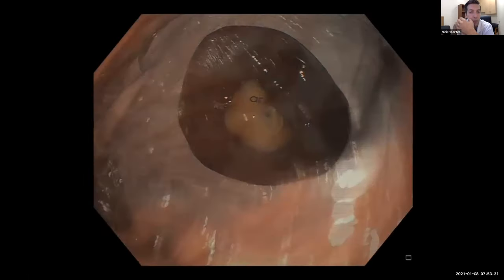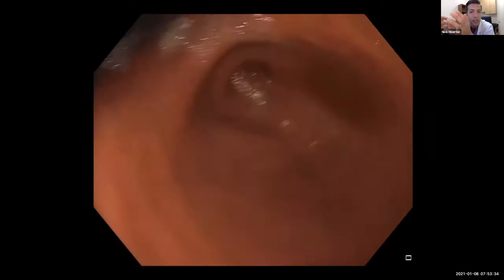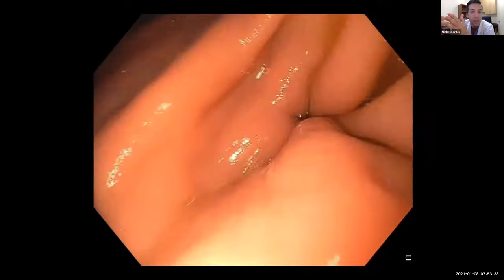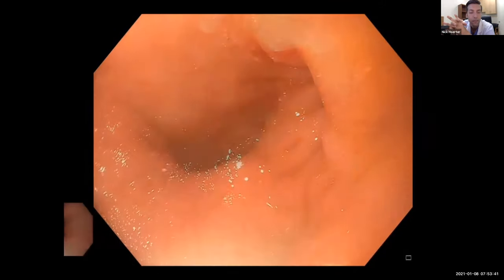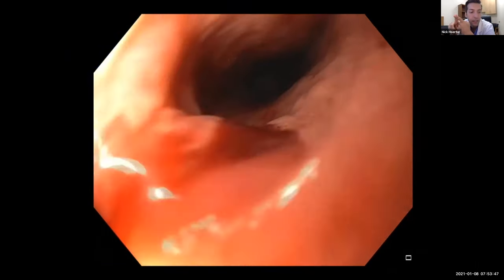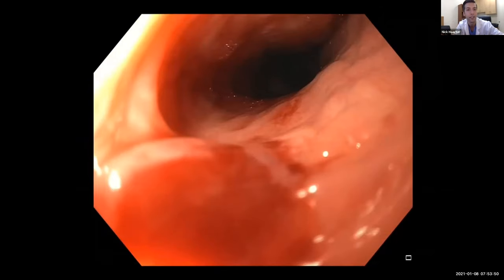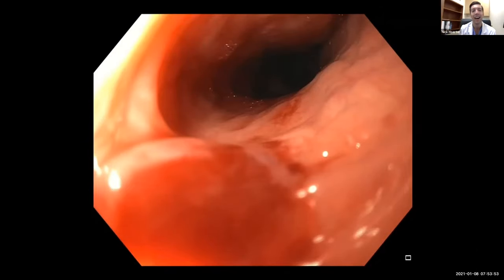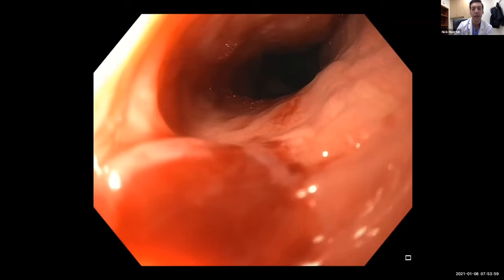The balloon deflates, turns into a balloon pancake, and then we use another tool from the removal kit — the viper forceps that grasps with little hooks that sink into the plastic — and then the balloon is removed. Even though this is technically simple looking, this is actually one of the more dangerous parts of the balloon process, because during removal it's very large and there's a lot of tension that can cause tearing. After removal, you want to inspect to make sure there was no damage — no gastric perforation. We go through the pylorus and the main areas of risk are the GE junction, which was clean in this case, and in the upper esophagus there is a shallow mucosal tear, but nothing too serious.